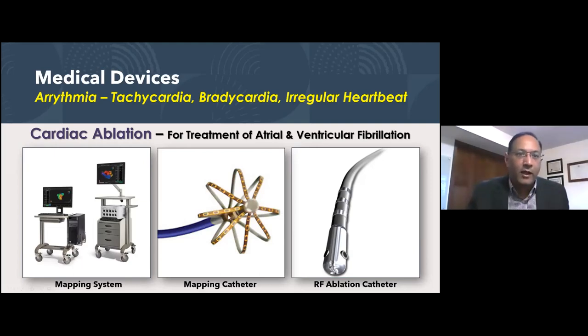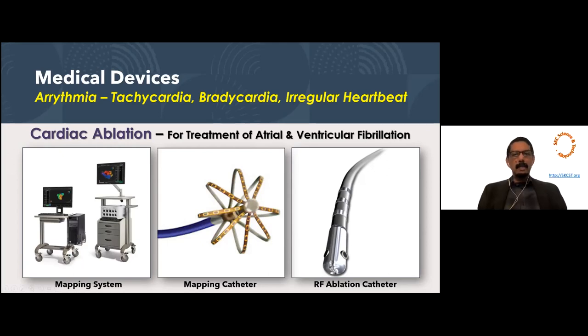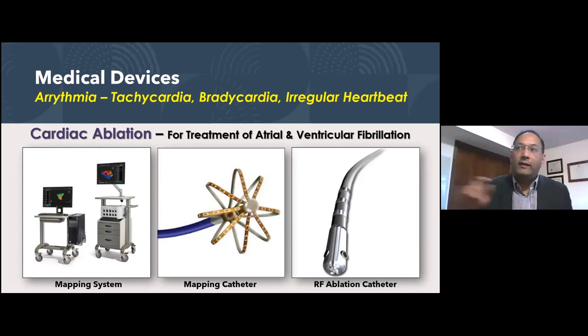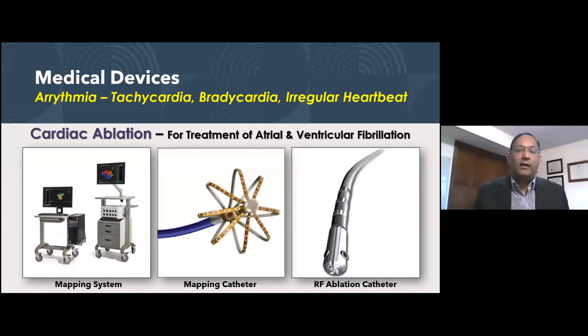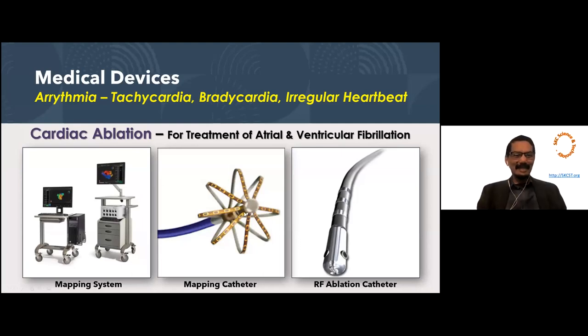But to your point, on these catheters, there are cameras and LEDs that are being placed now so that you can actually capture and then see tissues. What we see today is mostly the electrical view of things. The tissue view of things can be seen by these catheters. That's correct. Those are coming. Are those already deployed or available, or is it still under engineering stage for the ones with the cameras? In the world of cardiovascular devices, there is not one yet, but that technology is not new. Endoscopes use cameras, correct. But in any of these big companies who are leading 95% of the market, there isn't a product yet. We are working on one that I can tell you. No, that's okay. All right.